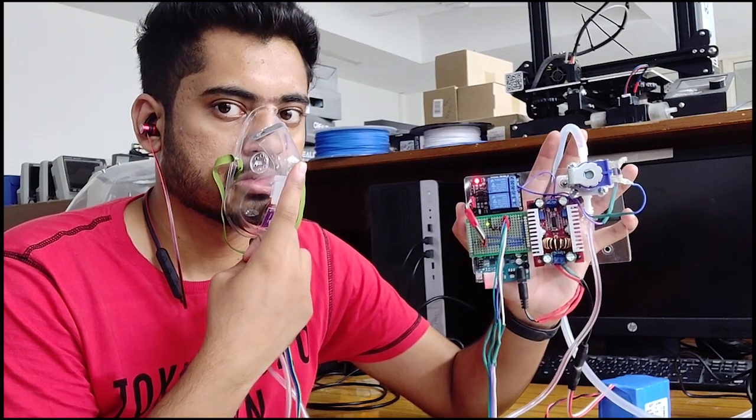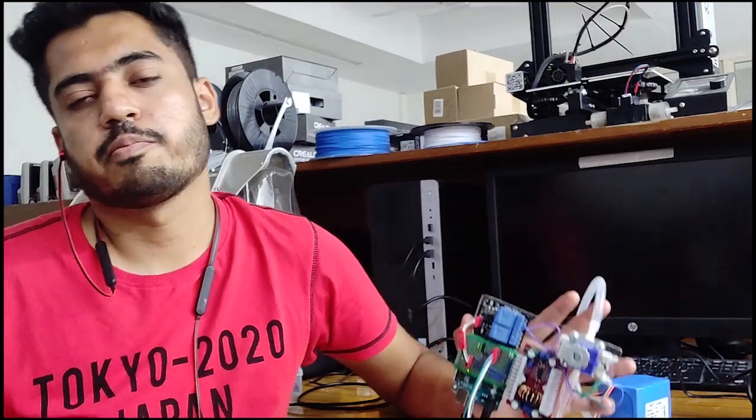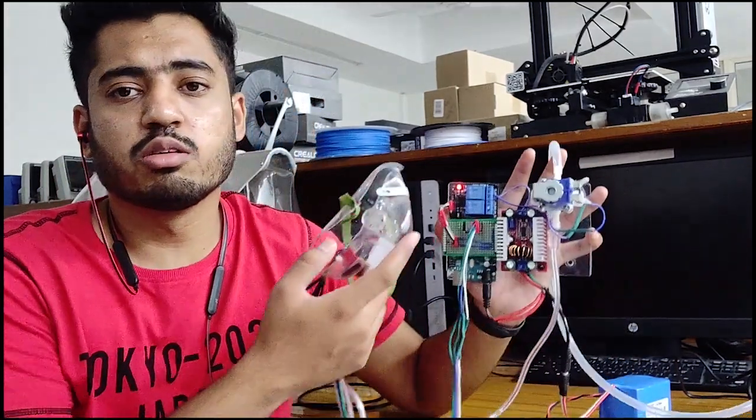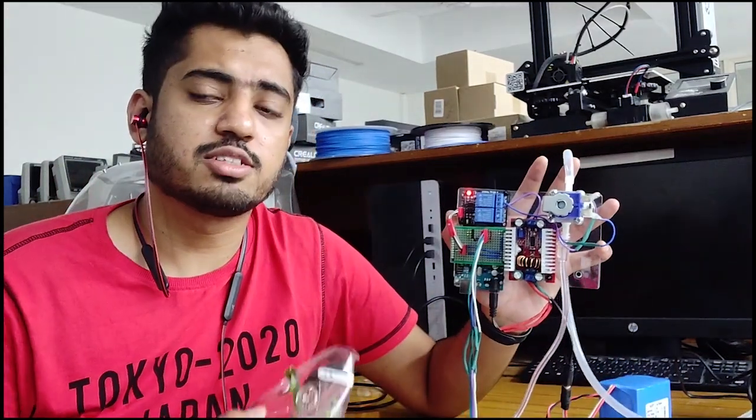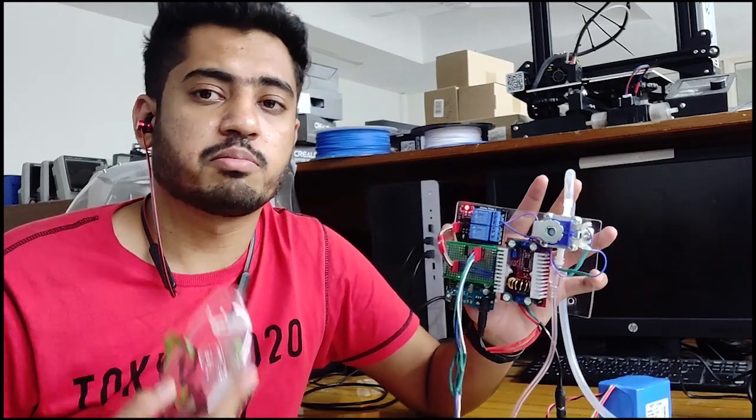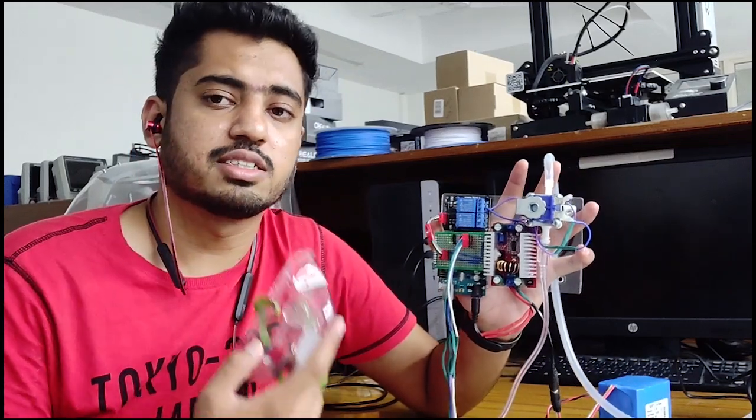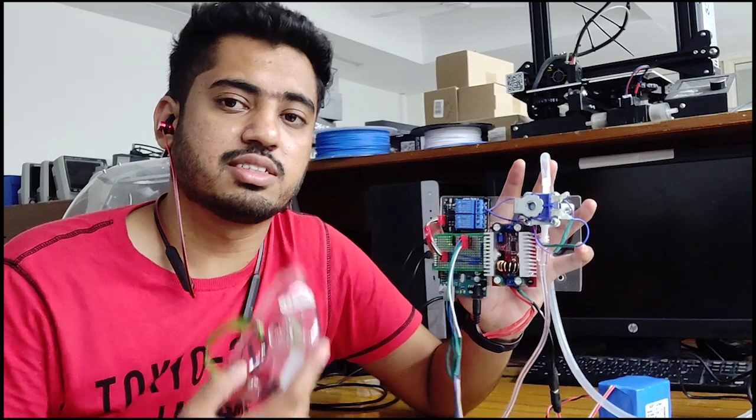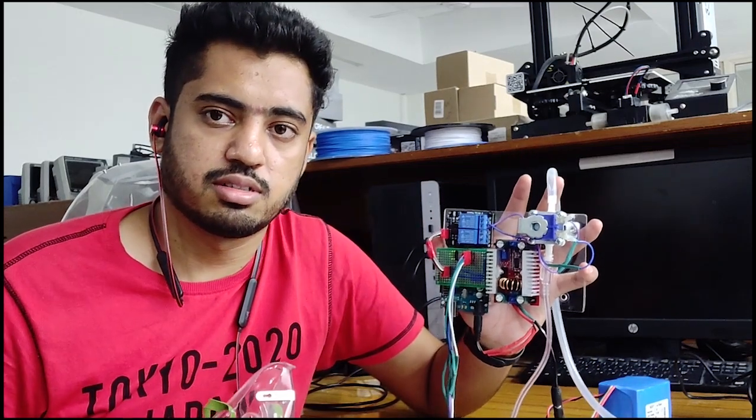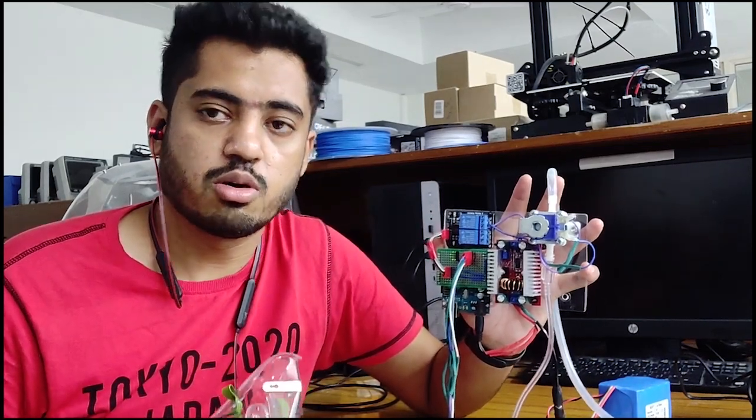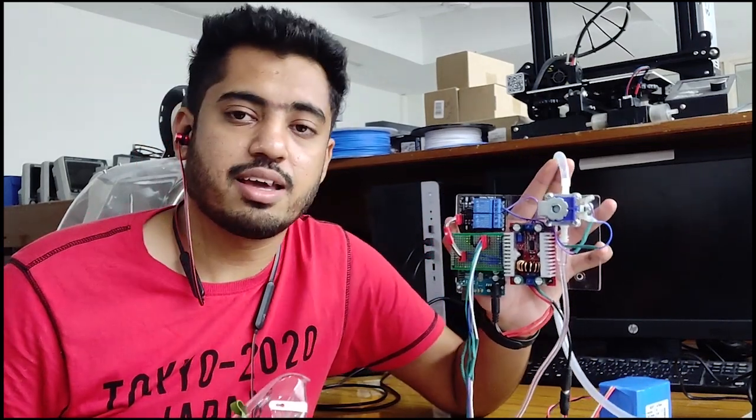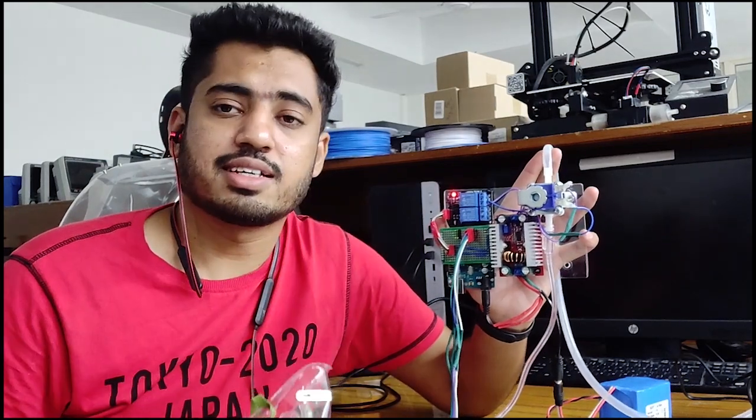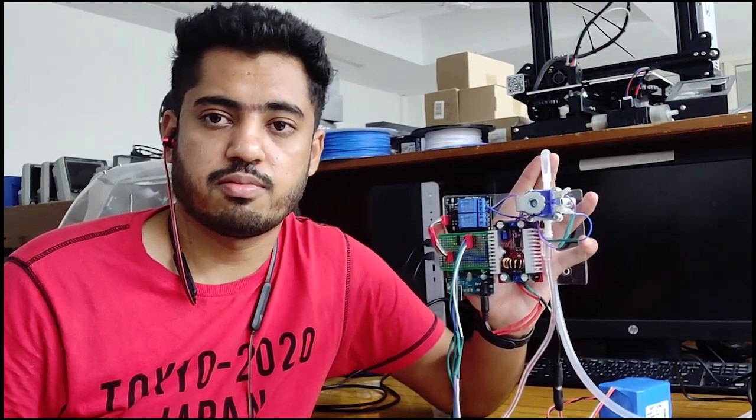As you can see, the opening and closing of the valve is totally synchronized with my breathing pattern. So this smart system can actually save a large amount of oxygen during the operation. We can see that this device can save millions of lives. Thank you.